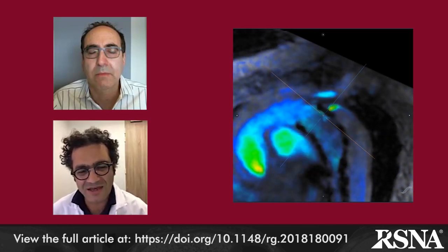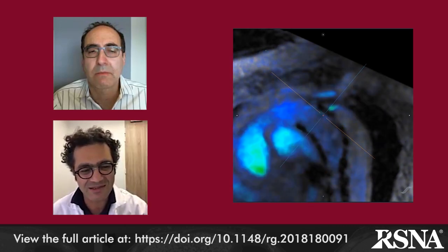So in the case of this patient, surgeons and endovascular radiologists were discussing if it was a type 1 or type 2 endoleak. And as you can see, we did this imaging. We don't have a lot of artifacts, and we can see very easily the false lumen, the true lumen, and the leak during systole going from the true lumen to the false lumen, and we see that it's a type 1 endoleak. So they just came and put an undergraft, a covered endograft, and that disappeared.